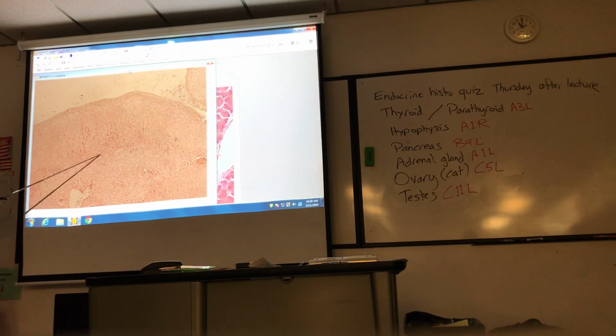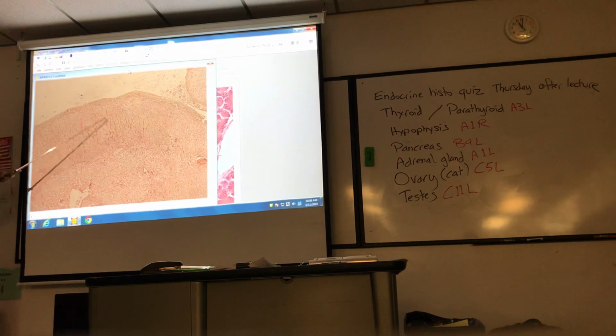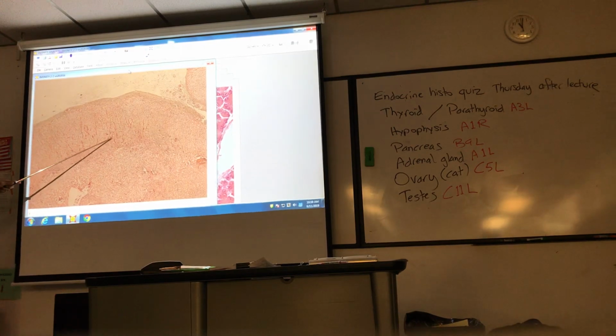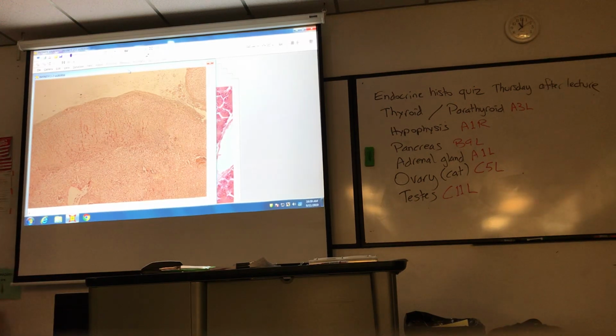Is that what you're thinking you see? Maybe? All this cortex, all this medulla. So if I have to identify that, adrenal medulla, that's the capsule. Therefore, our salt, sugar, sex is in effect. Zona glomerulosa, fasciculata, reticularis. I can even see little blood vessels, blood in between the cells there. Okay, so the corticosteroids can get into the bloodstream. Once again, salt, sugar, sex. I'll take a picture of that.